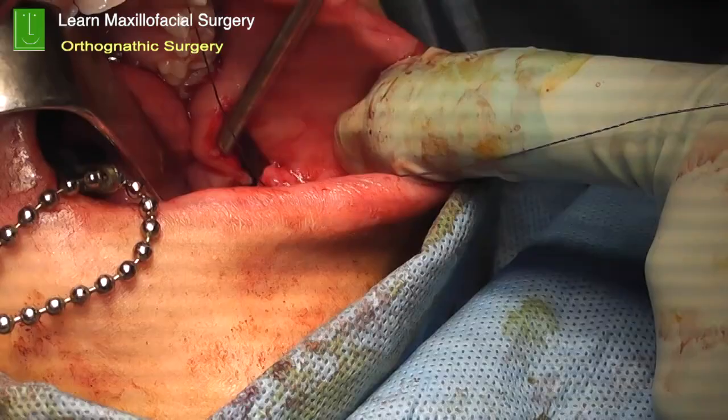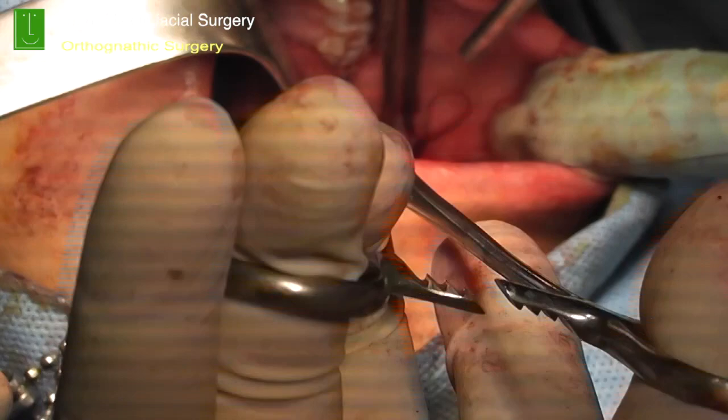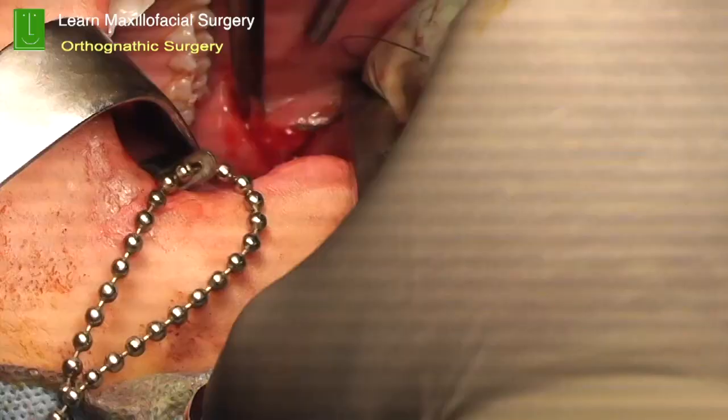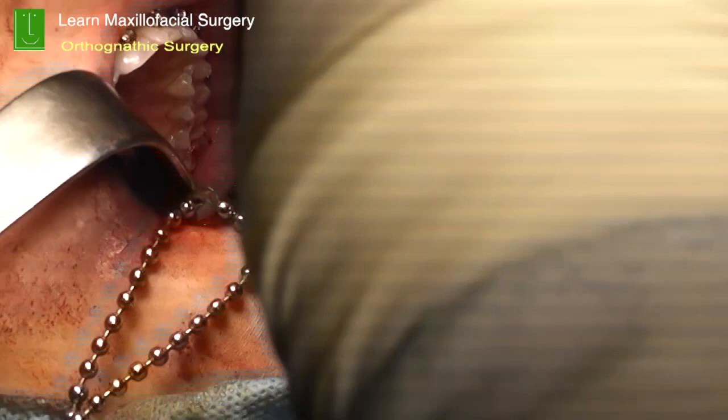Simple interrupted stitches or a mattress stitch is good enough, which approximates the tissues very well. A simple interrupted stitch can make a big difference in bringing the tissues together. Take a good 5 millimeter bite away from the edge so the tissues get bunched up and you're able to get good primary closure.